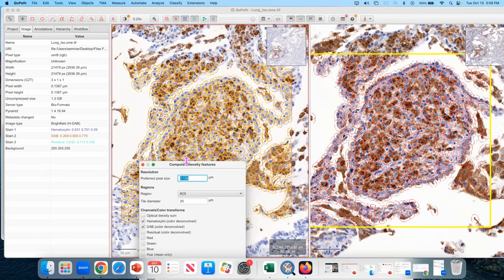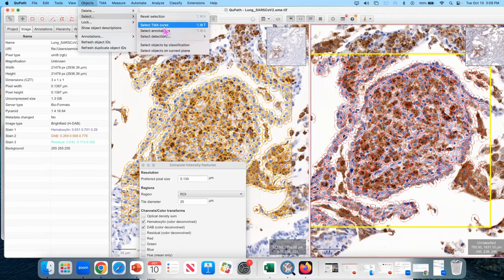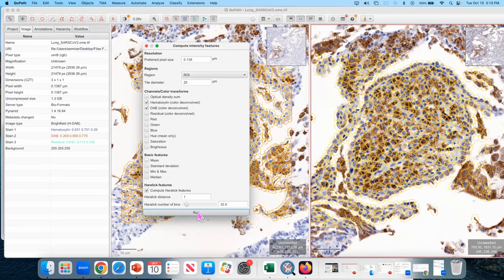So I've done this on this image. Now I need to do the same on this image. I also need to select the cells. I need to repeat this processing. And now if you have 17 images to process, this is the workflow. You open 17 windows and you apply those sequentially and you try not to make a mistake. No, that's not the way you do it. You do it by scripting, which we're going to do after coffee break, which is coming soon.